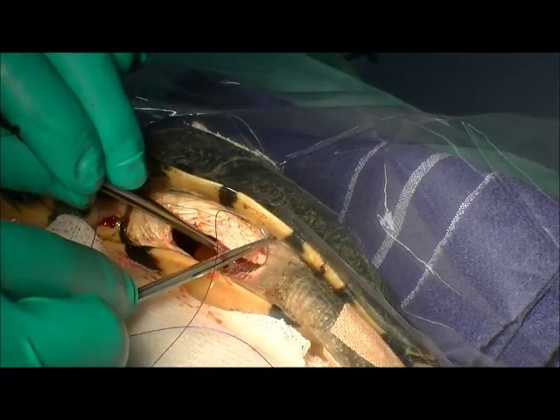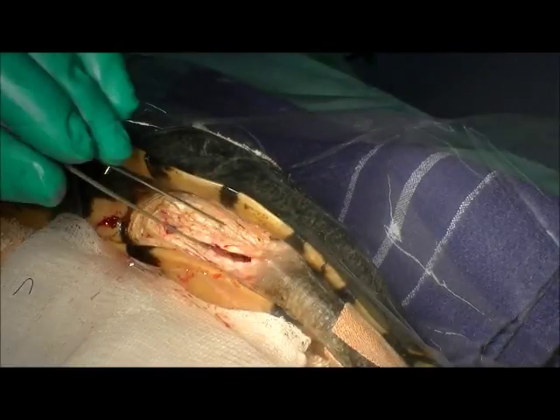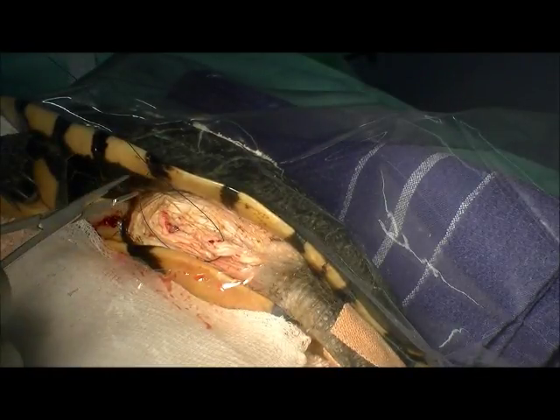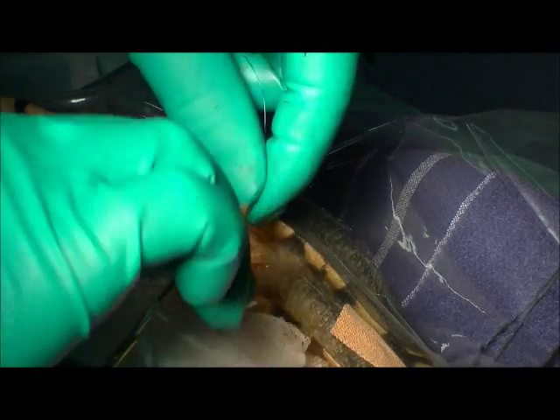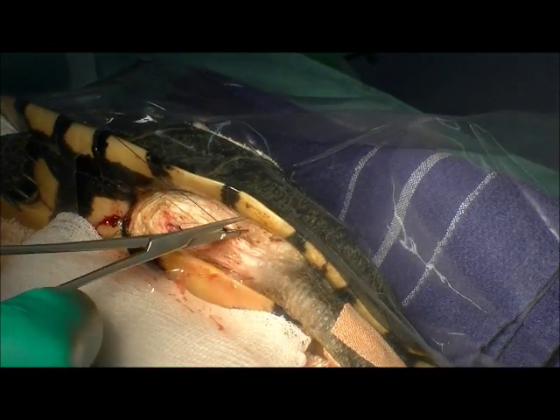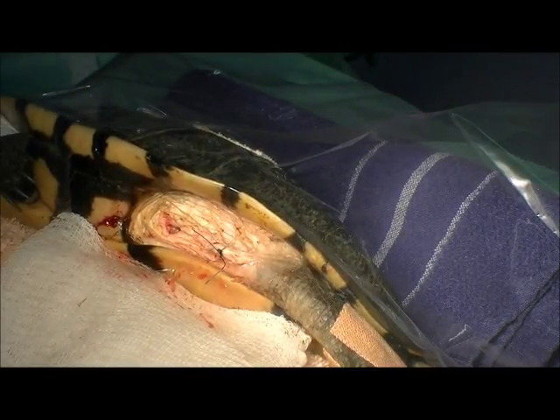So to stitch her up, we're just going to close up the muscle layer down in here, and then close the skin layer. The muscle layer is all nice and closed now. With these skin wounds, the skin is going to take a little while to seal, so she can't go back in the water just yet. There's some debate about how long to keep them out of water — I tend to only leave them for a couple of days. Then I get the owners or wildlife carers to let them have a 15 to 20 minute swim once a day for a couple of weeks, and after that let them go back in the water as normal. Stitches come out in six weeks.